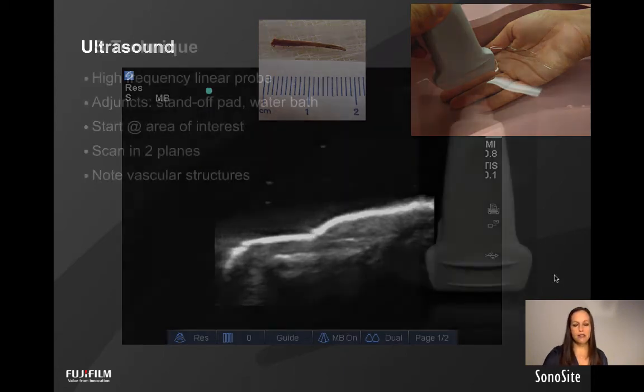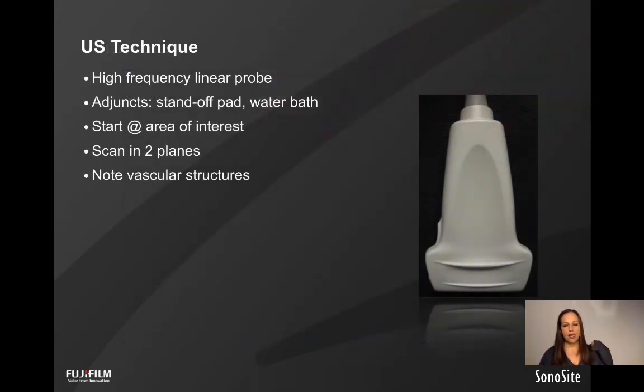Now, foreign bodies can be very easily identified. The technique is very similar to what I mentioned before for cellulitis and abscess. You use a high-frequency linear probe.